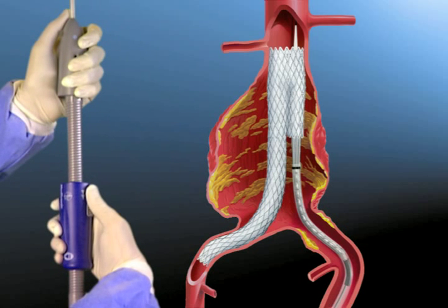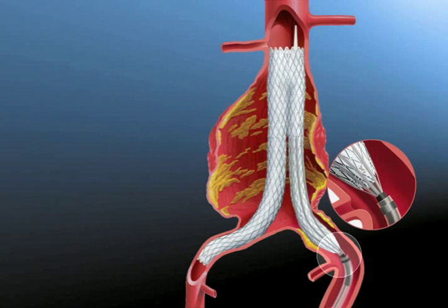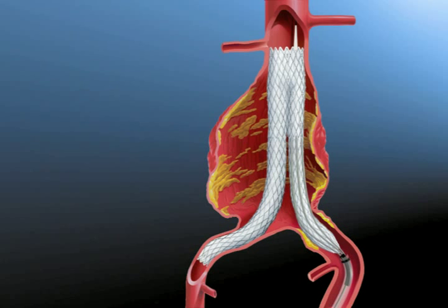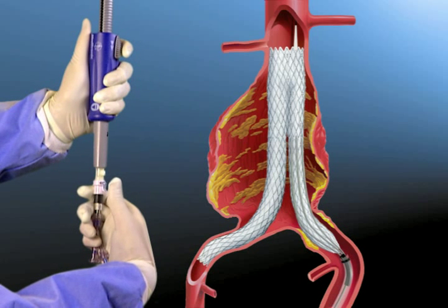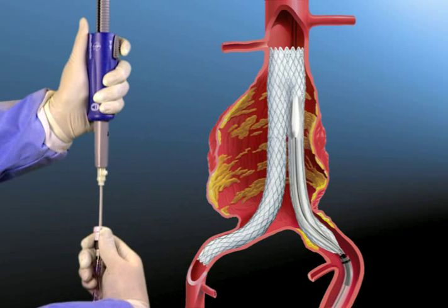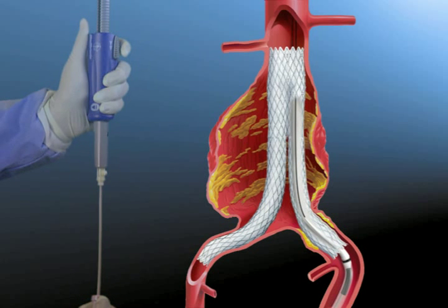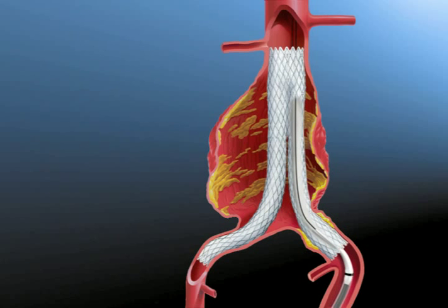Continue deployment of the stent graft until the graft cover is just below the distal radiopaque marker on the Accelerant Delivery System. To remove the delivery system, depress the quick disconnect button to retract the tapered tip and runners. Use continuous fluoroscopy and watch the top end of the AneuRx stent graft while slowly pulling back the tapered tip and runners into the graft cover of the delivery catheter.